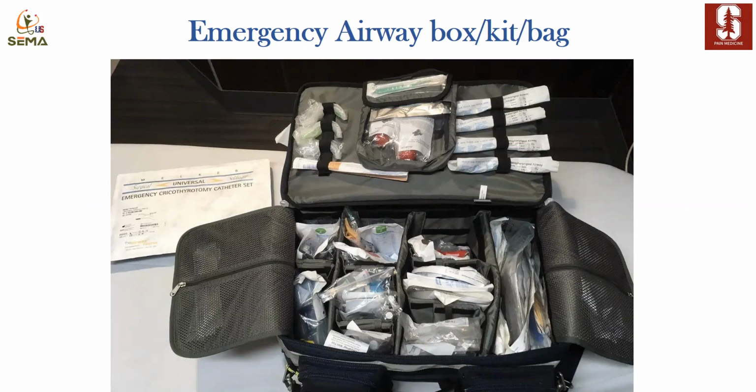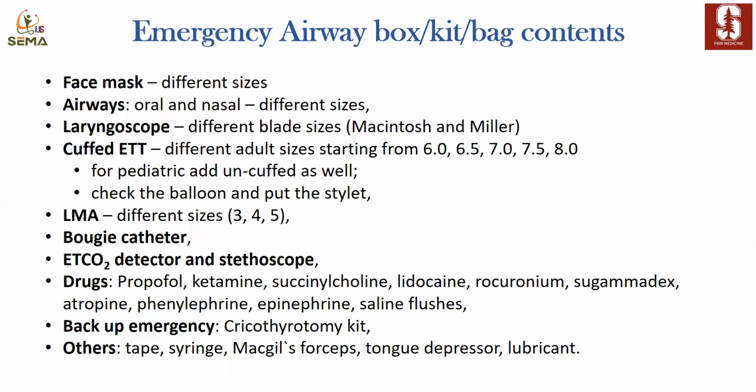So what you should put in this bag: face masks of different sizes, airways, oral and nasal, laryngoscope with different blade sizes, ET tube, and I would make sure that I test the balloon of the ET tube, put the stylet in, be prepared.